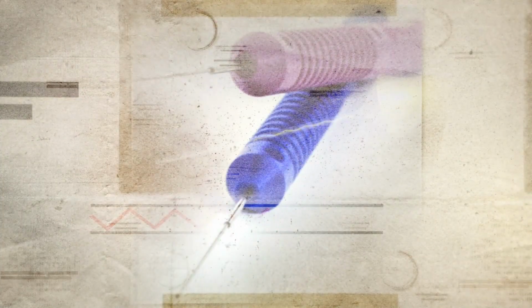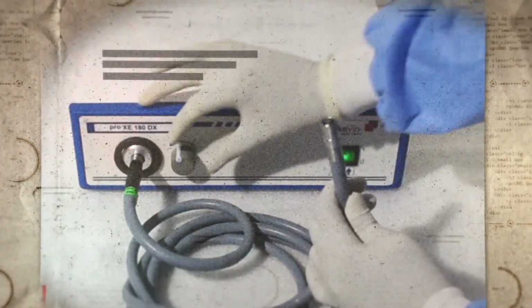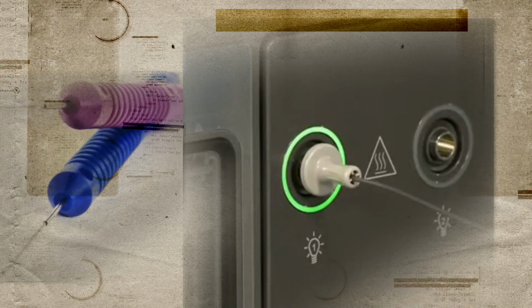Handheld fibers exhibit smaller illumination angles. However, they are more focused. Current illumination systems consist of high-intensity light sources and single-use ENDOILLUMINATION fibers up to 30 G. Existing devices employ xenon, halogen, mercury vapor lamps or light-emitting diodes, LEDs, as light sources. Commercial systems are available from Synergetics, Alcon Laboratories or DORC.